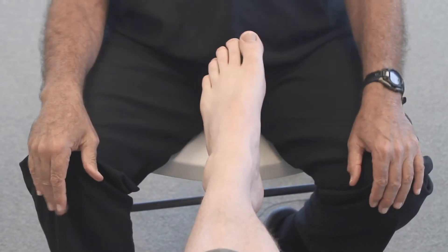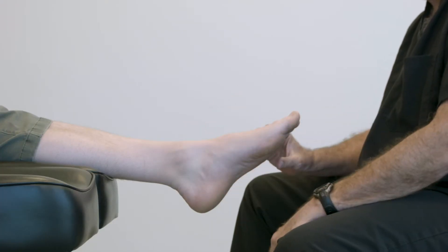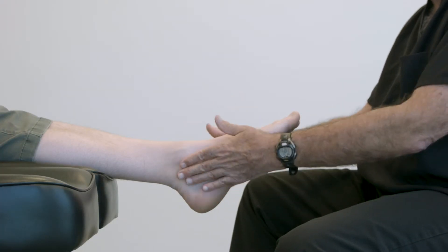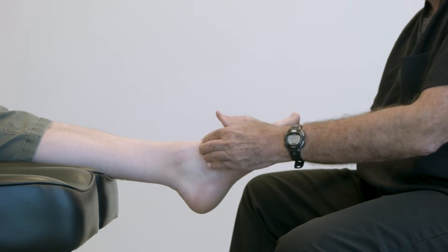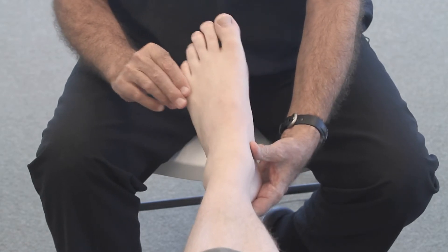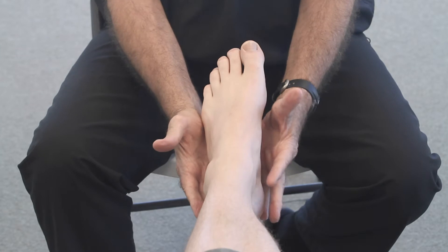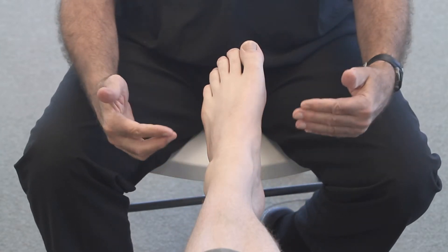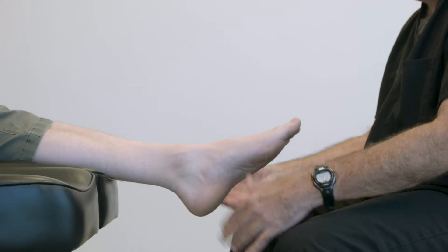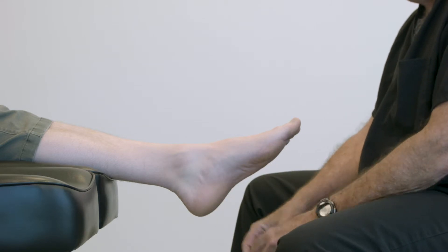You don't want the foot just hanging like this when taking a scan. If you take a scan of the foot in a relaxed position, it is not in subtalar neutral and there's all this play available at even the ankle and the mid-tarsal joint. There are angular changes captured in this relaxed position which are not desirable when you're making a foot orthosis or a Ritchie brace.